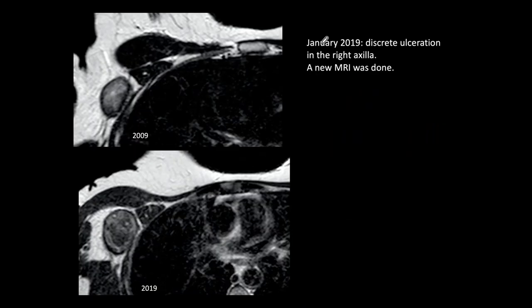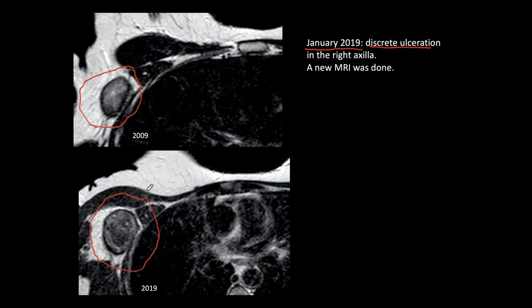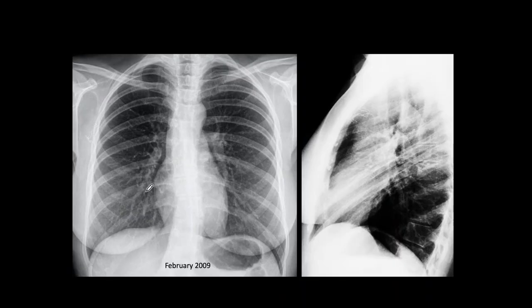Until January 2019, about 10 years after the intervention, the patient discovered a discrete ulceration on the right axilla. A new MRI was done and compared to the previous one. In 2009 there was a mass; in 2019 the mass has increased slightly in size and the interior looks different. Since everybody was puzzled, it was decided to review all previous examinations, including the chest X-rays.